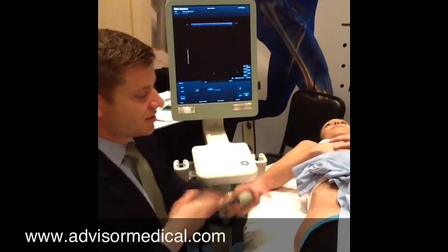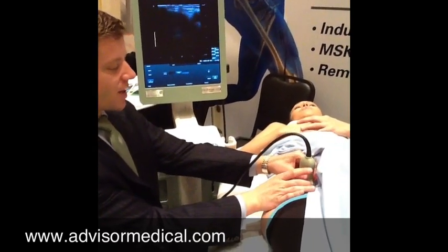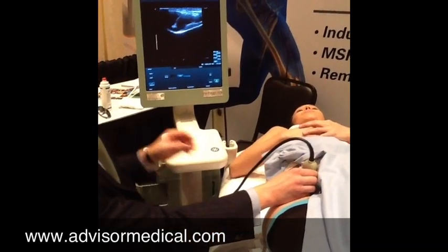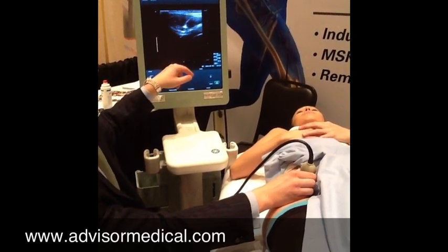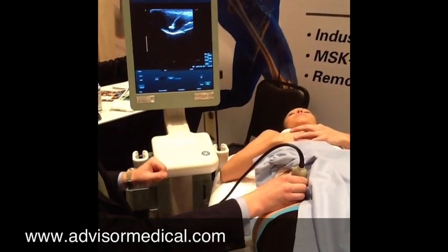I'm going to take the transducer and draw that line, and every time I drop it down, let me just describe what we're seeing here. This is the pelvis and this is the iliopsoas tendon coming across in the short axis.